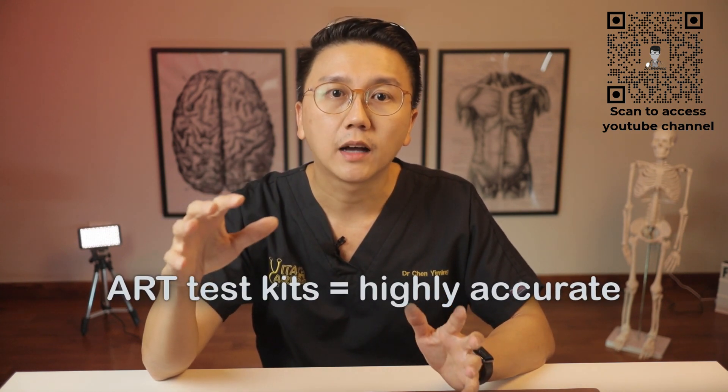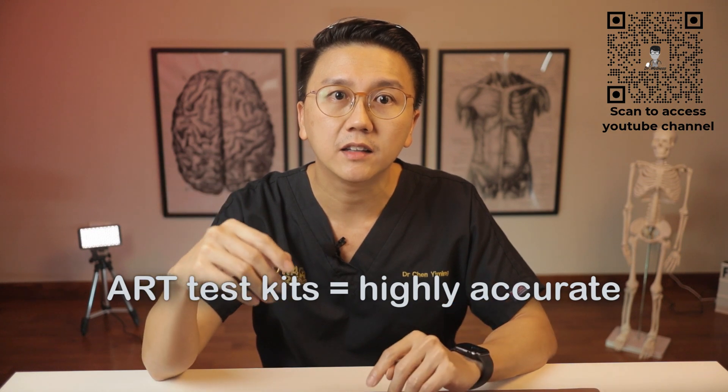So now today, I'll show you guys how to perform an ART test kit on yourself.